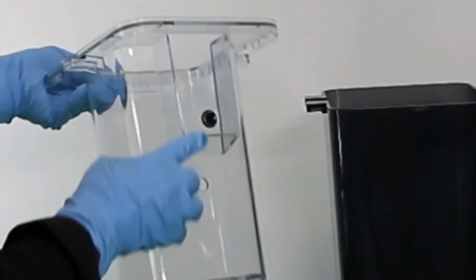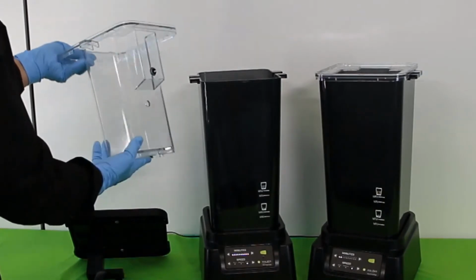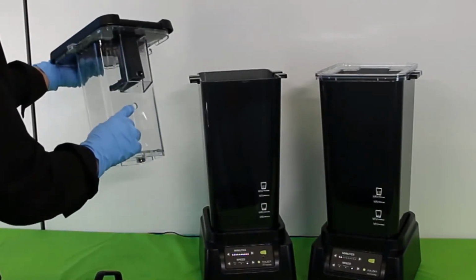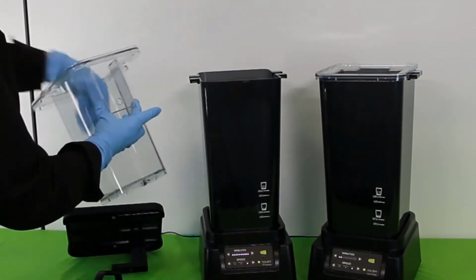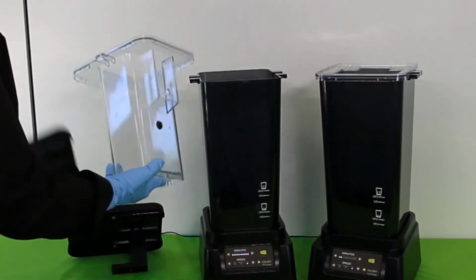For working with a large build table hanger, the upper overflow hole must be closed. Therefore, the isopropanol can circulate by the lower hole. Close the overflow by inserting the plastic plug from the inside into the corresponding hole, and remove it by pushing it out from the outside.